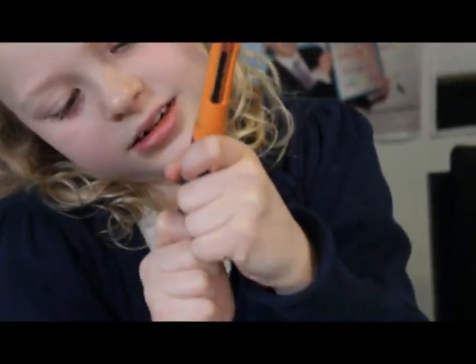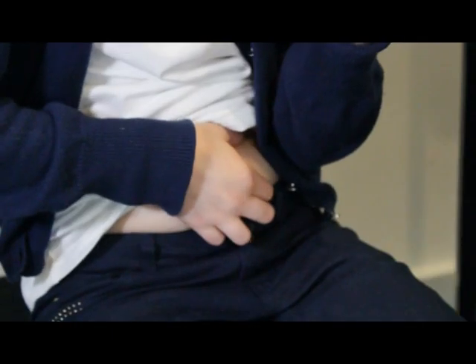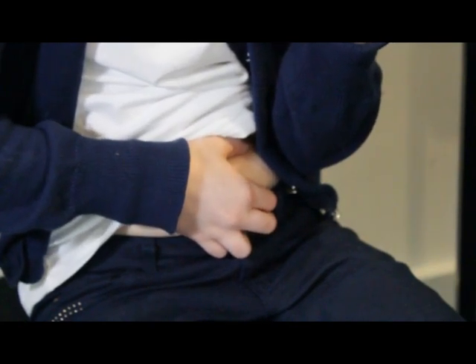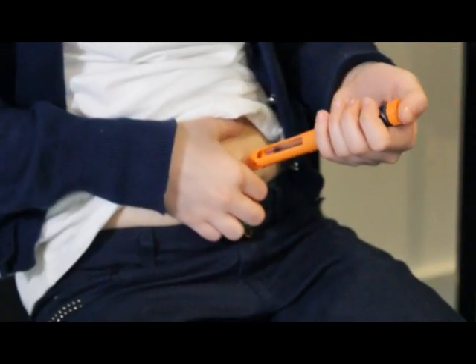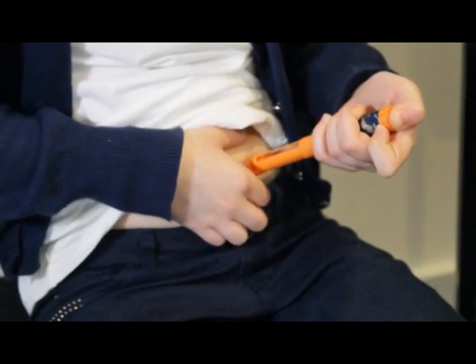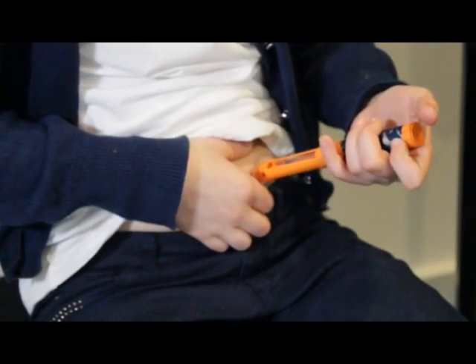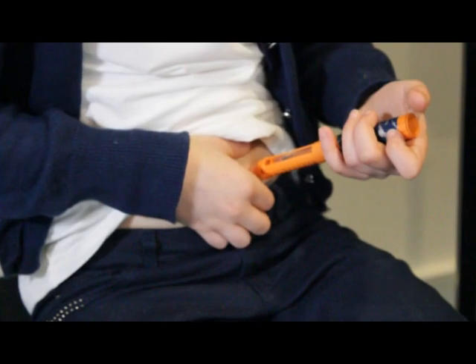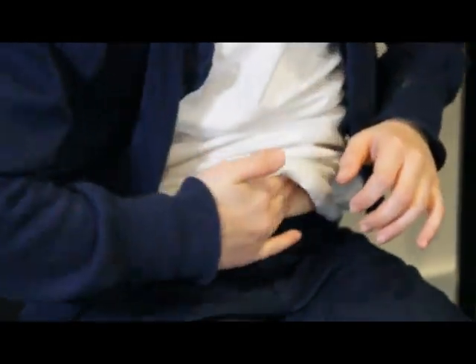Set the pen to your dose by turning the knob until you see the correct dose. With your child, decide which part of their body you're going to inject. If you've been advised to, either lift your child's skin with your free hand or get your child to lift the skin gently with their free hand, and insert the pen at a 90 degree angle. Gently push down on the plunger until the pen goes back to zero. Count to ten slowly, then pull the needle slowly out of the skin and release the skin fold.